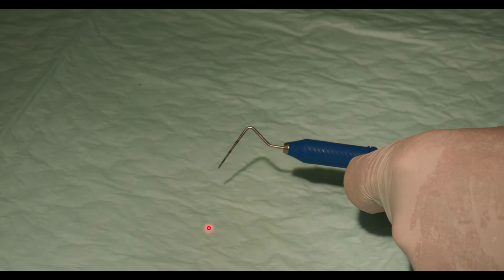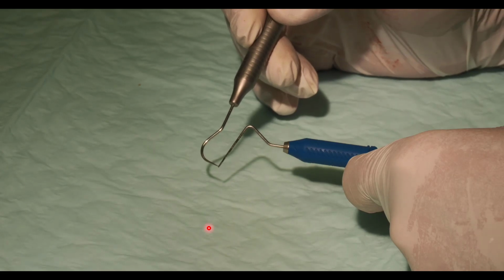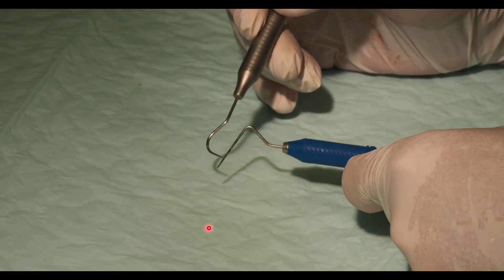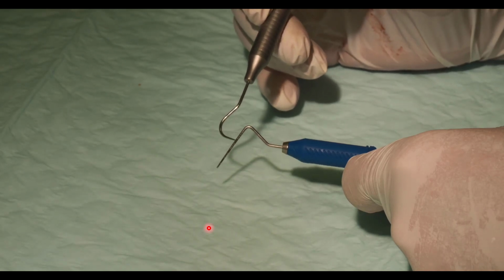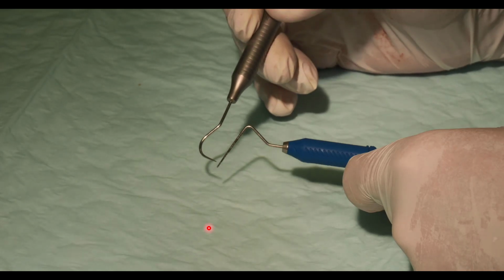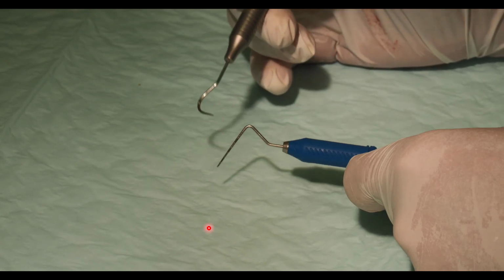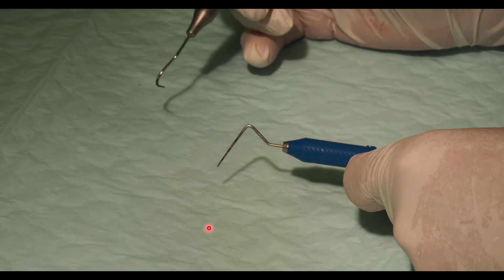So this is an example of a periodontal probe. Note that there are probably 50 different markings that you can get. This is just one of them, and probably my favorite. In this particular one, each one of these lines is 1 millimeter. So that's 1, 2. When it gets to this darker line, the first part of it is 3, the back part of it is 5, then 6, 7, 8, and then 9 somewhere in the middle, 10, and I hope you're not getting very often up into this area. But you've got to know what each one of these markers means, because sometimes they do 3, 3, 3, and 3. So make sure you know what the right markings are for your probe, and then use it appropriately.